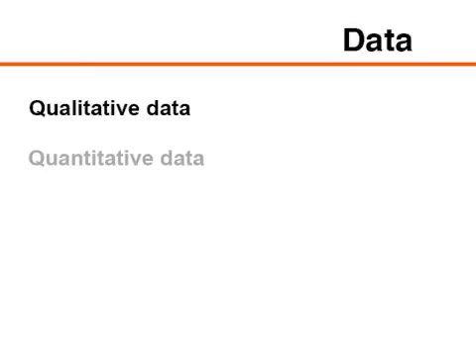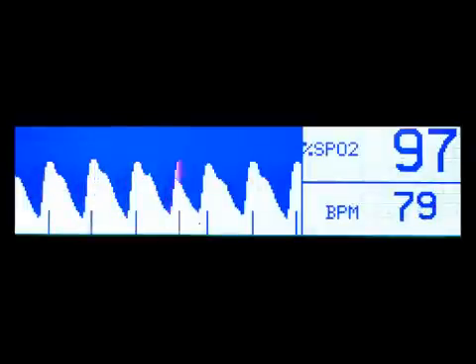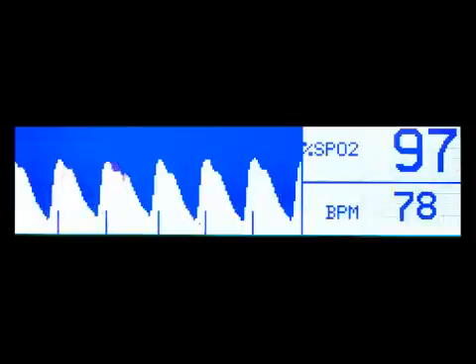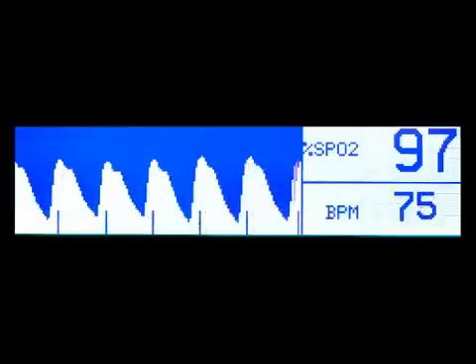Pulse oximetry provides both qualitative and quantitative data. The qualitative data are obtained through the sounds emitted by the pulse oximeter. These sounds correlate with the level of oxygen saturation. A higher pitch indicates higher oxygen saturation, and a lower pitch warns of decreasing oxygen saturation. The pulse oximeter provides quantitative data through the display of a pulsatile waveform that corresponds to the flow of arterial blood. The numbers displayed indicate the hemoglobin oxygen saturation and the pulse.